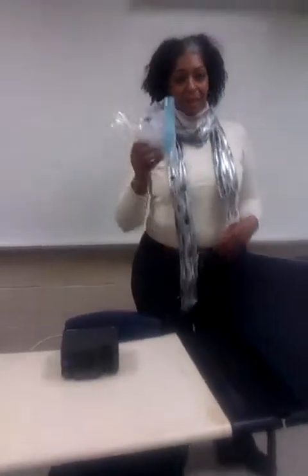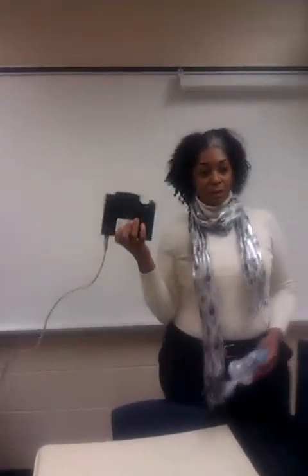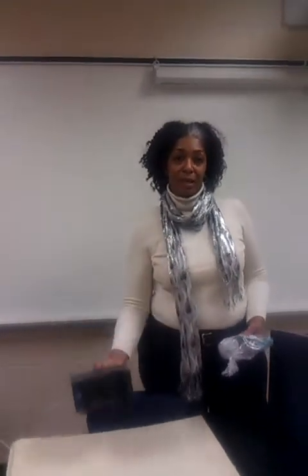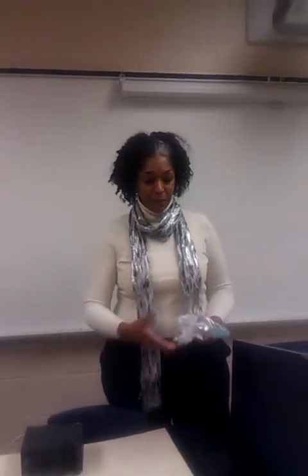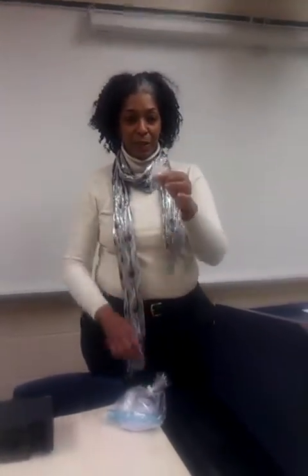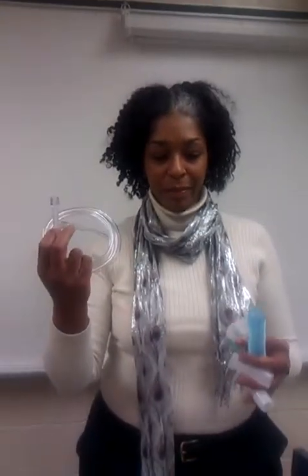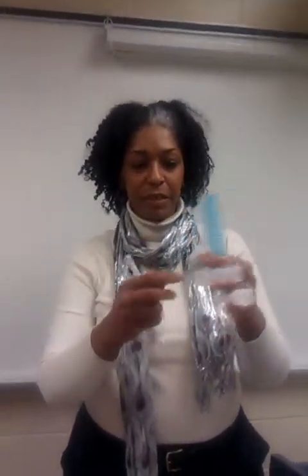You must have a nebulizer kit and a nebulizer machine. The machine is basically just an air compressor that forces the air through a tube into the nebulizer cup in order to deliver the medication. Inside the nebulizer kit, you will find a nebulizer cup, corrugated tubing, a T-piece, a mouthpiece, and tubing. These 5 pieces go together this way.